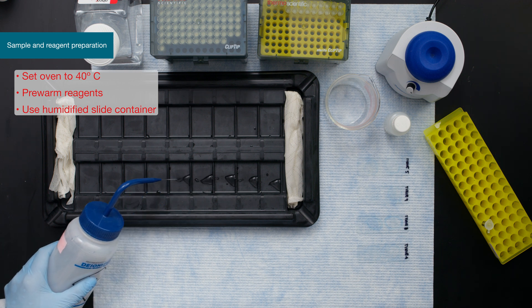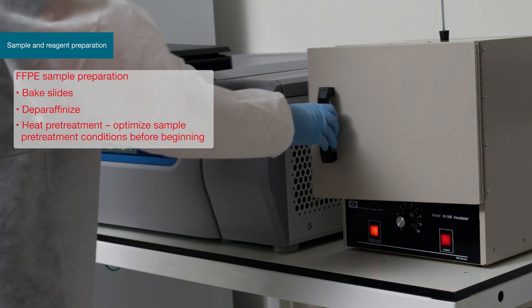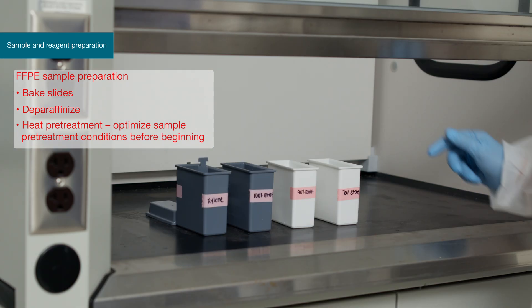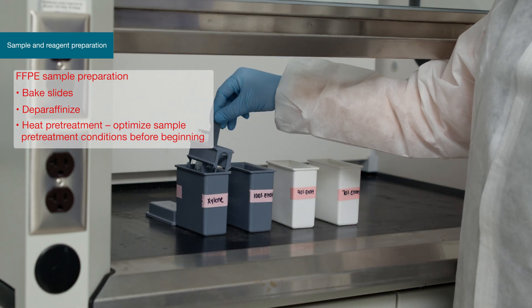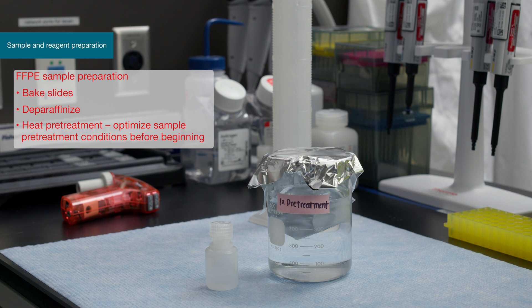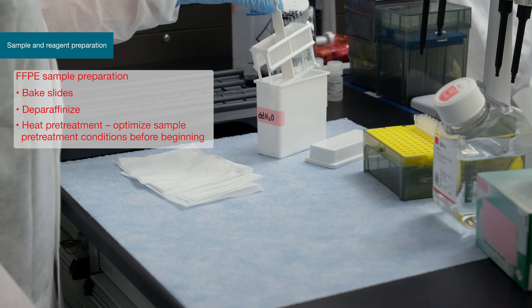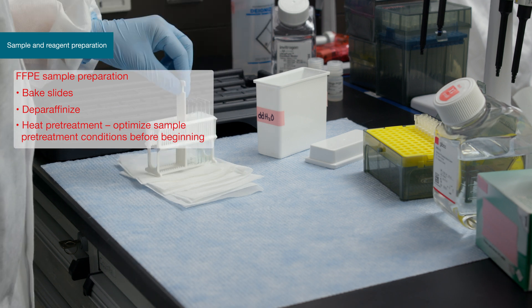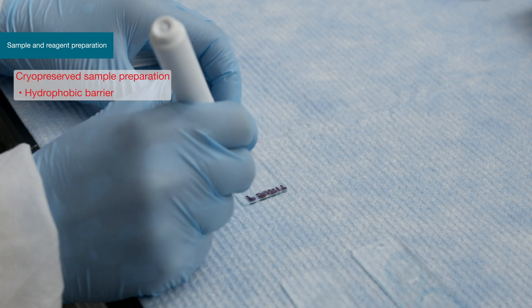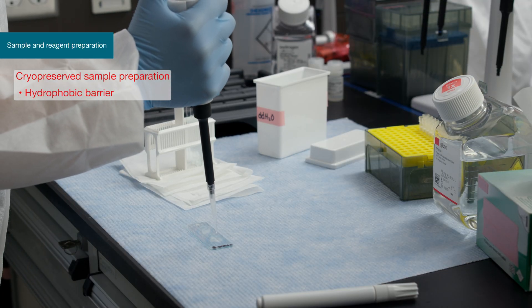Both cryopreserved and FFPE tissue samples can be used in this assay. If using cryopreserved tissue, samples should be fixed overnight before beginning. If using FFPE samples, slides may need to bake to promote tissue adhesion. FFPE samples should be de-paraffinized and rehydrated. After de-paraffinization, perform the heat pre-treatment by submerging the slide rack into the 1X pre-treatment solution on a hot plate heated to 90 to 95 degrees Celsius. Incubate for the optimal time, then wash the slides with distilled water twice and transfer to PBS. Draw a hydrophobic barrier around the tissue sample, allow to dry, and cover the tissue with PBS to ensure it doesn't dry out, taking care not to touch the barrier.